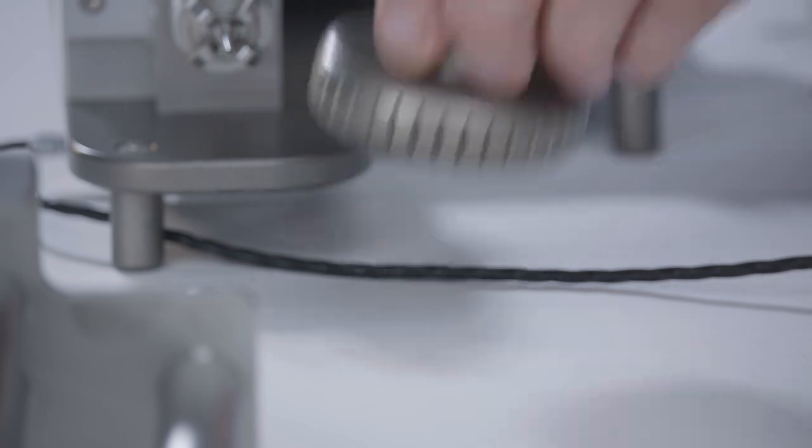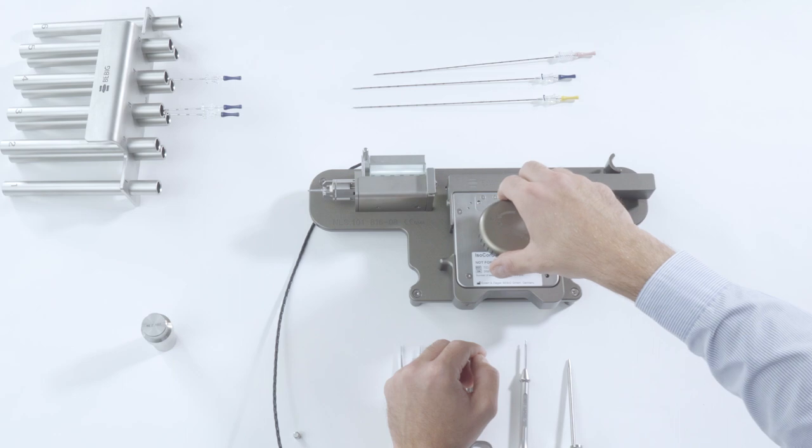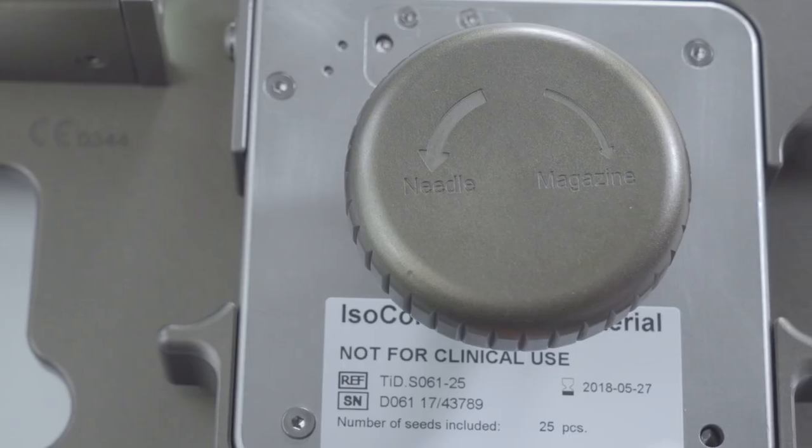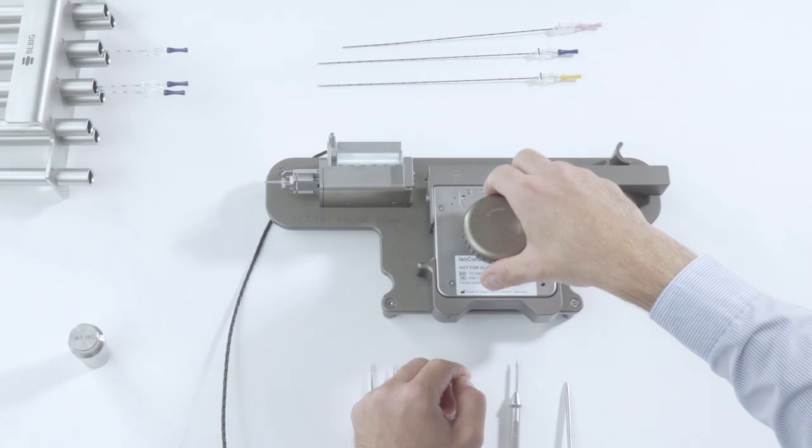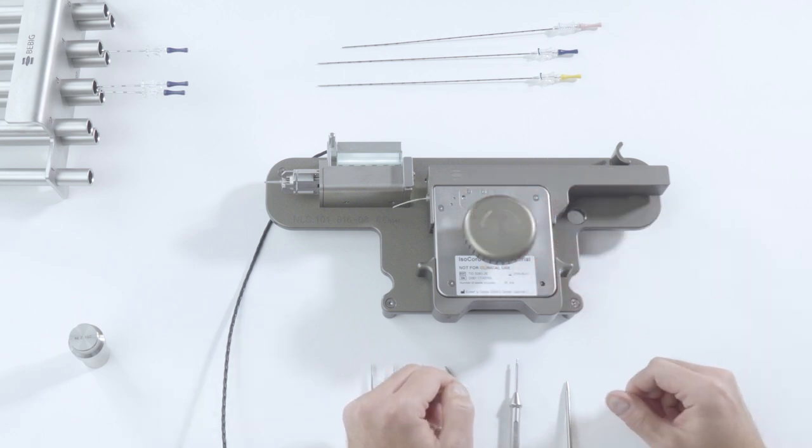To test whether the seed chain can move, insert the knob into the magazine and carefully turn the knob counter-clockwise in the direction marked needle. The knob should turn easily and the seed chain should protrude from the magazine holder.